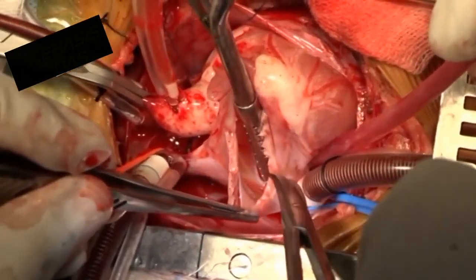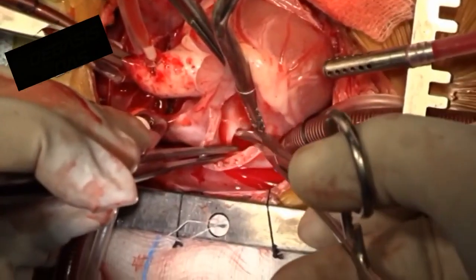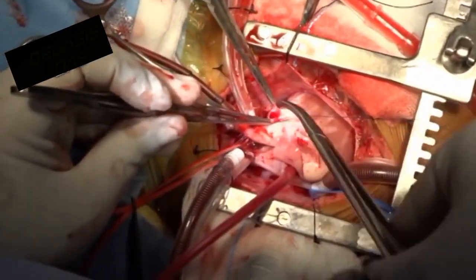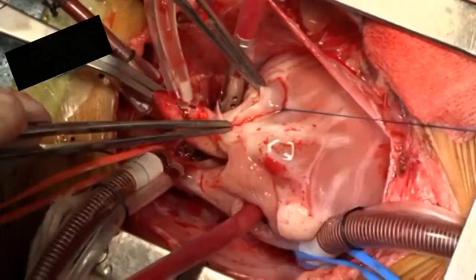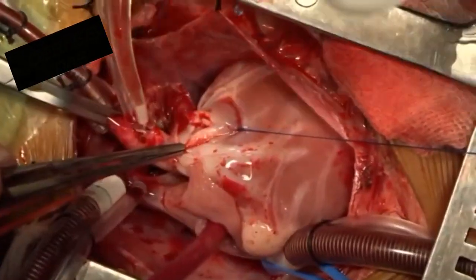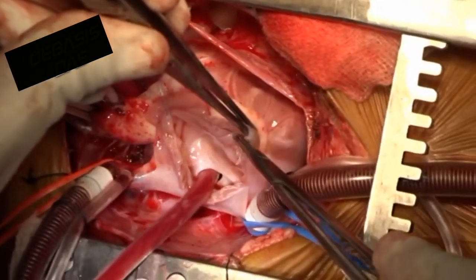The heart has arrested. The right atrium is opened parallel to the atrioventricular groove. The foramen ovale is dilated and a vent is placed in the left side. Attention is now focused on the pulmonary artery, which is opened longitudinally. The pulmonary valve is inspected and distal branch PAs are assessed with appropriately sized Hegar dilator and a vent is placed in the pulmonary artery.